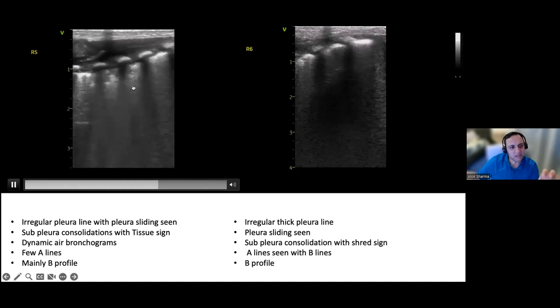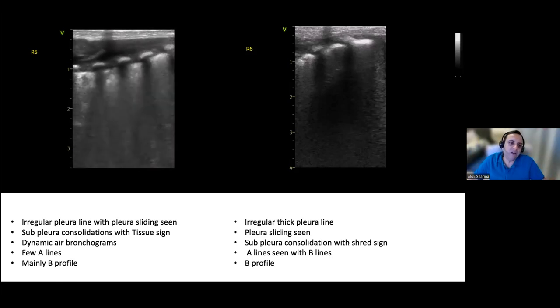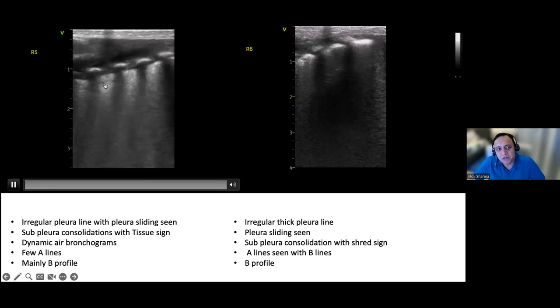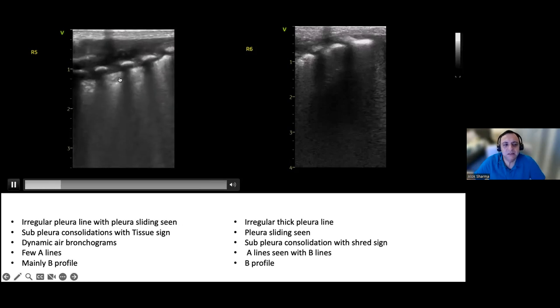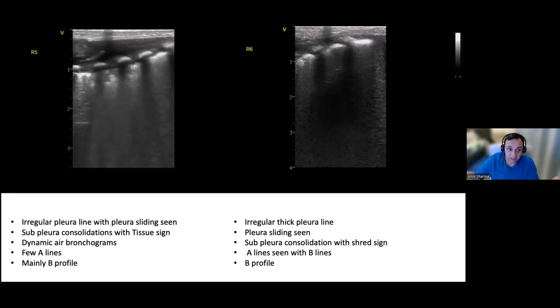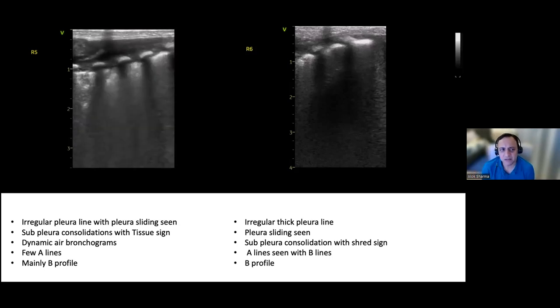They basically appear and disappear. They're in the same position. It's not like a snake moving in and out. So for me, you have some static air bronchograms in the middle, maybe on the left side as well. But really what you can clearly see is this slightly moth-eaten appearance below the pleura, with a pleural line that's quite blurred. So overall, that's consolidation with a little bit of atelectasis, and there are some static air bronchograms there. But I wouldn't say dynamic air bronchograms, and I wouldn't be saying tissue sign just yet. Okay.